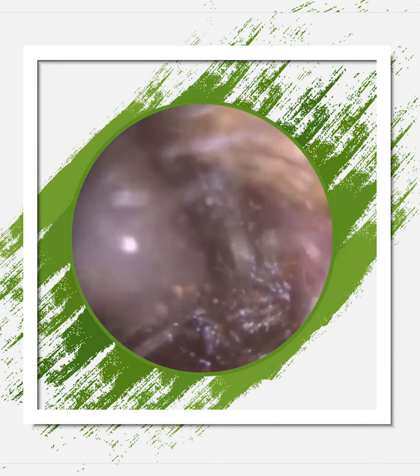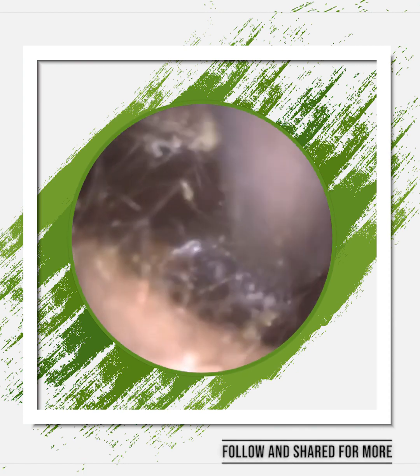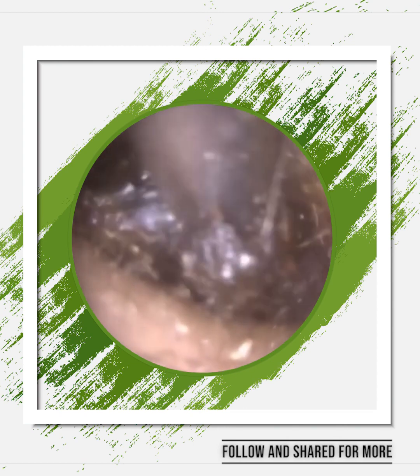But it's a bit tricky extracting this from the first bend. So I'm going to bring this forwards, and you can see this is the first narrowing, the first isthmus, and it's getting trapped here. Really having to pull it through, extract it through.